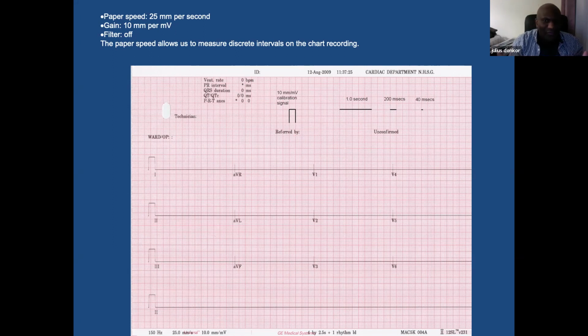A really good reason to use a filter is a patient with Parkinson's disease who has tremors. Otherwise, do a good skin preparation and keep the frequency spread from 0.05 to 0.5 up to 150 hertz, so you can get as much signal as possible. You don't want to cut off any of the important signals.